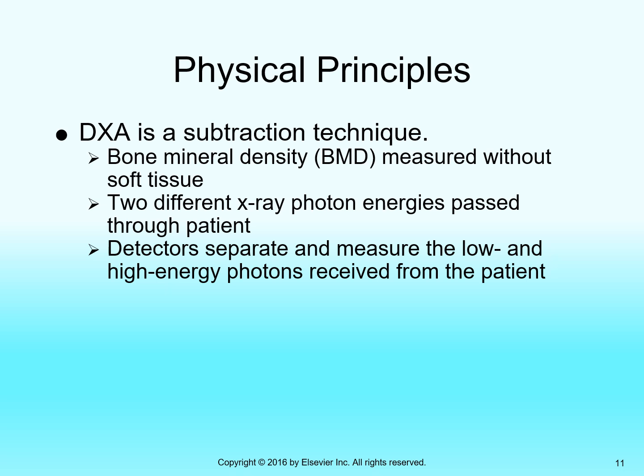The detector will measure the remnant beam exposure, and then it will automatically, mid-exposure, boost the kVp to something closer to 100 kVp. Now, are those energies exact? No, but it is going to go from low energy to high energy, okay?